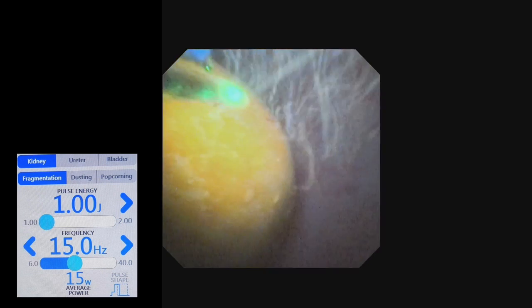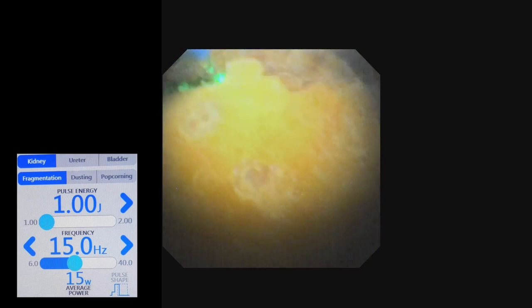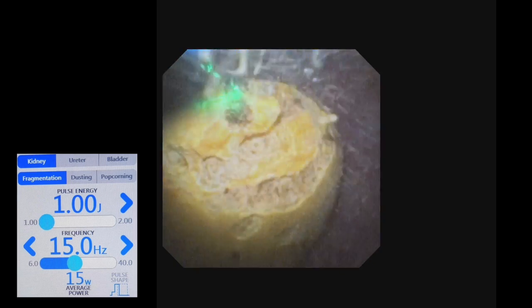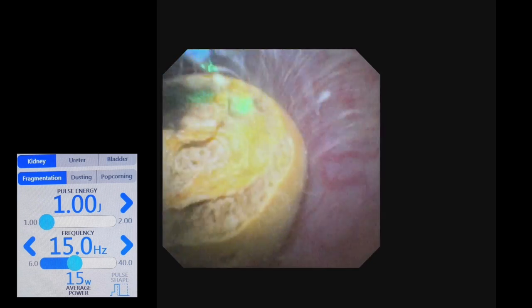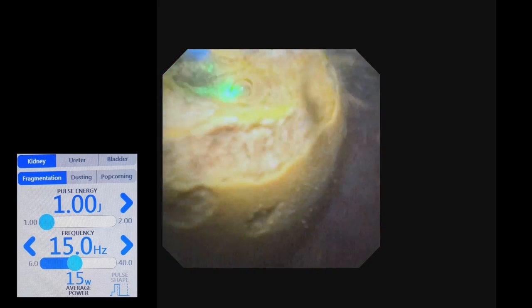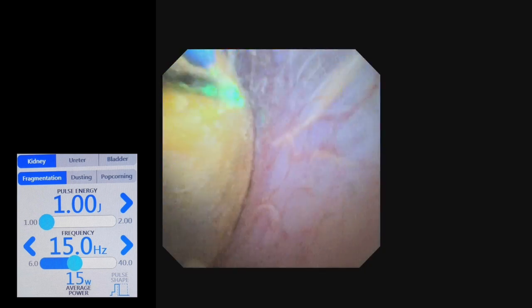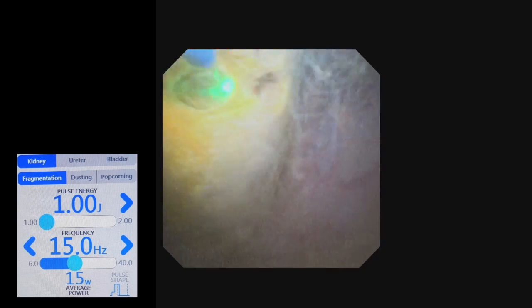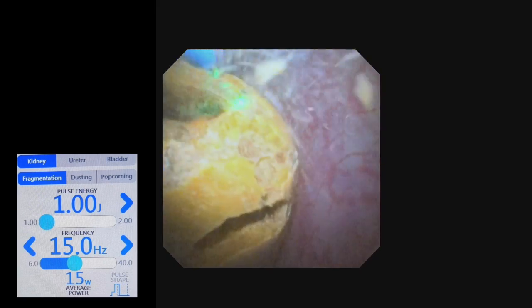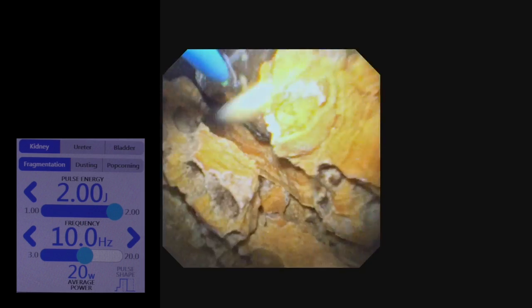Laser lithotripsy was done using thulium fiber laser. Initially, painting of the stone was done using settings of 15 Hz and 1 Joule in fragmentation mode, because we wanted to paint the stone — if big fragments formed and migrated, it would be difficult to trace them. However, at one point we found that painting was not possible due to difficult maneuverability.